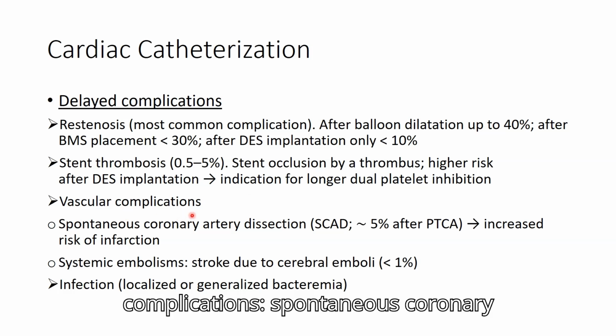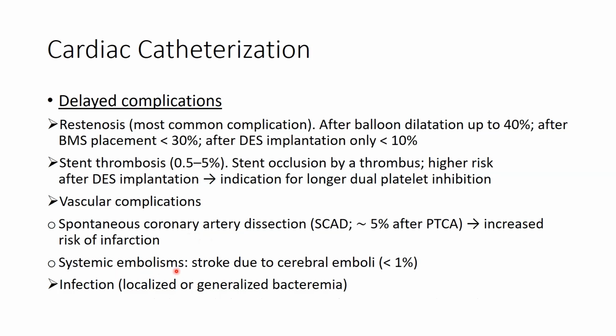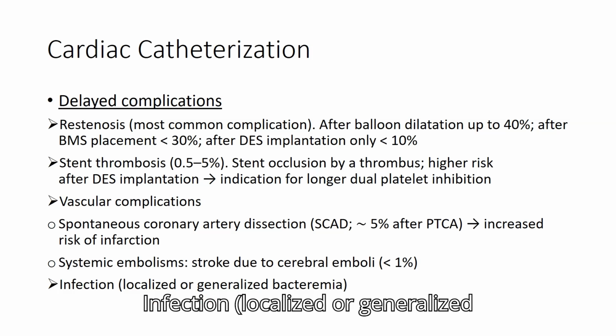Vascular complications: spontaneous coronary artery dissection, systemic embolisms. Infection, localized or generalized bacteremia, can also occur.